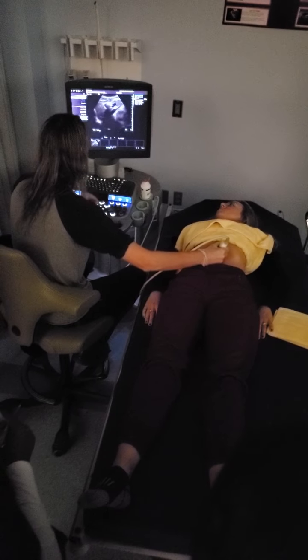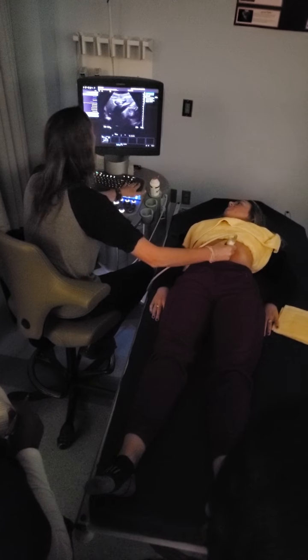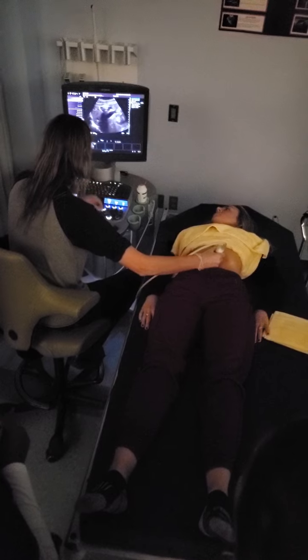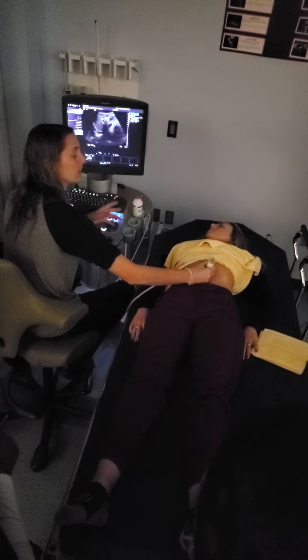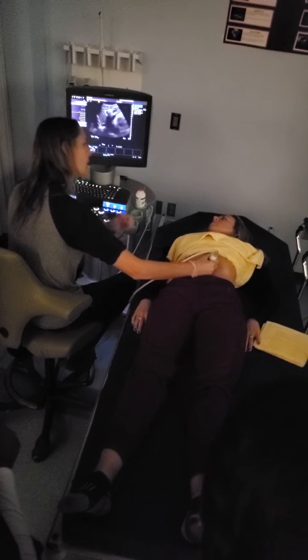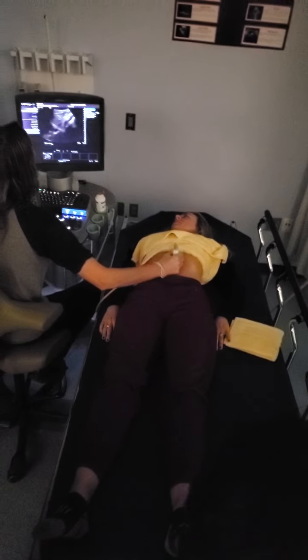And then, what else do we have to worry about? It's very deep. TGCs or possibly 2D. And we're still not there, are we? So I'll preemptively make some adjustments, knowing that while she's not breathing, I'm not wasting my time on her breath, fiddling with my buttons. Okay, when you're ready, big breath in, hold it.